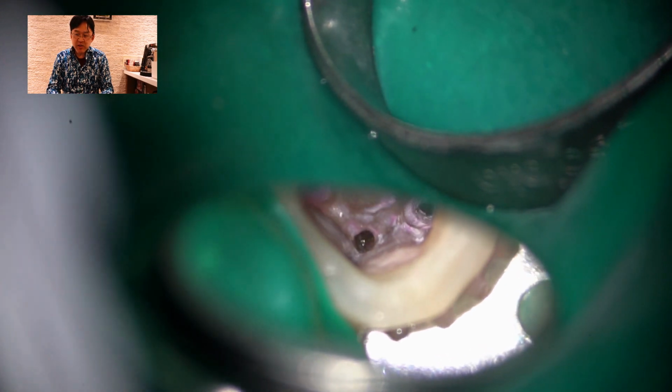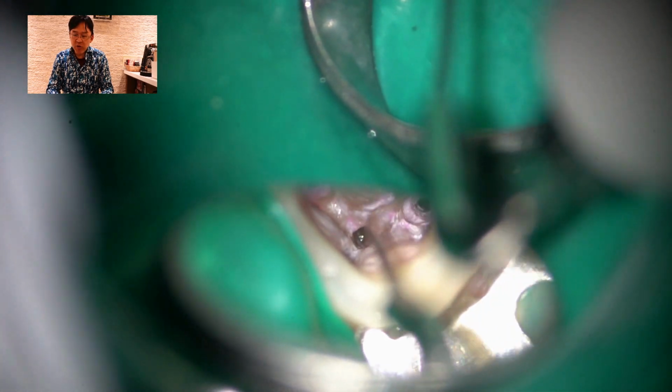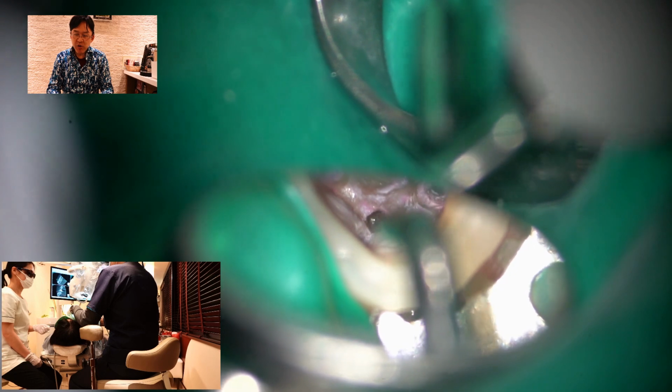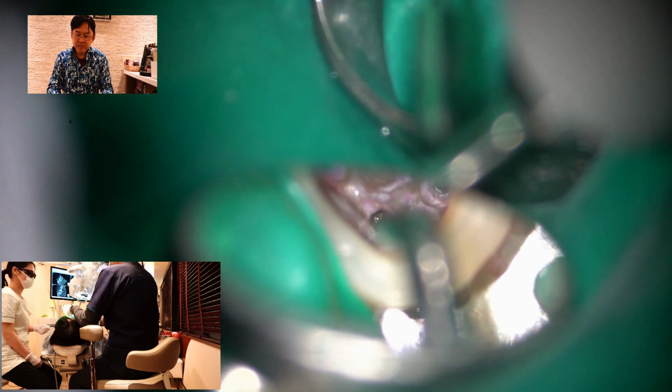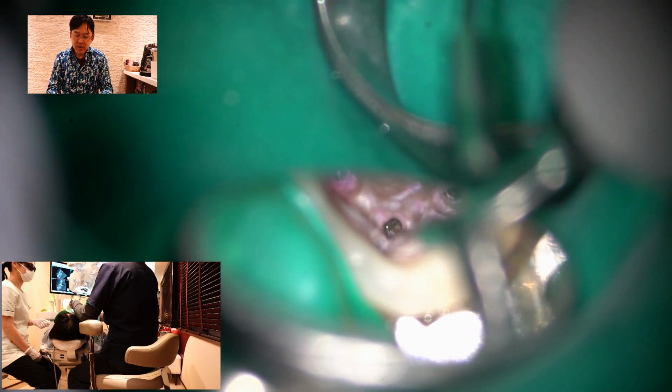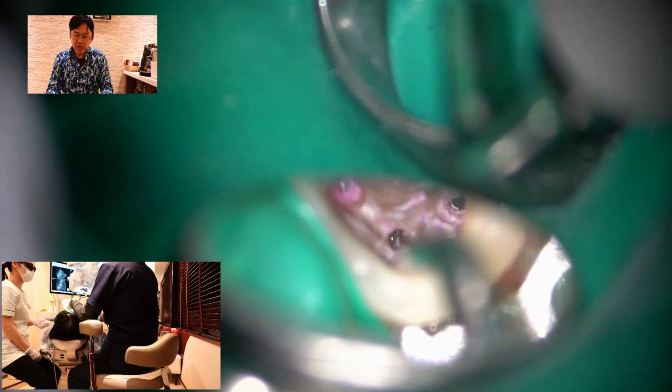First, I like to create a small space between the inner wall and the broken instrument with a katana tip. I'm using a pecking and a pulsing motion at the same time, as you can see. So the instrument is flexing. It's obviously flexing because it goes back to the original place.